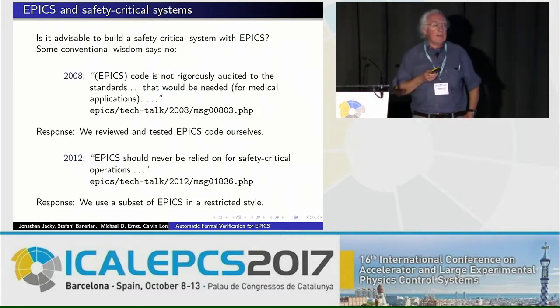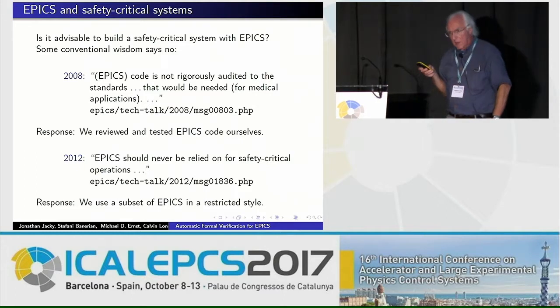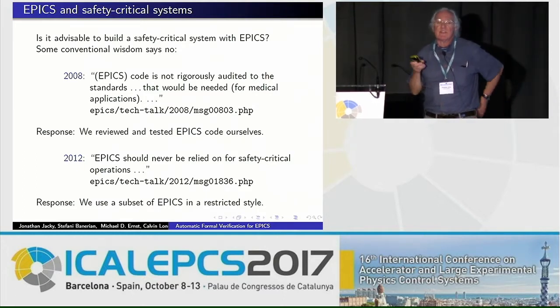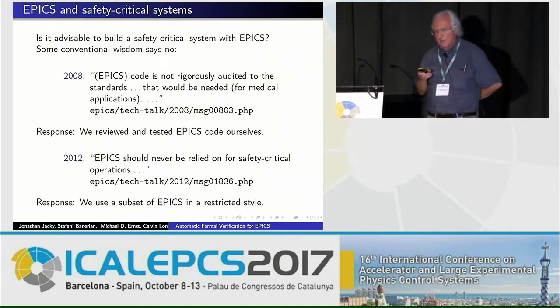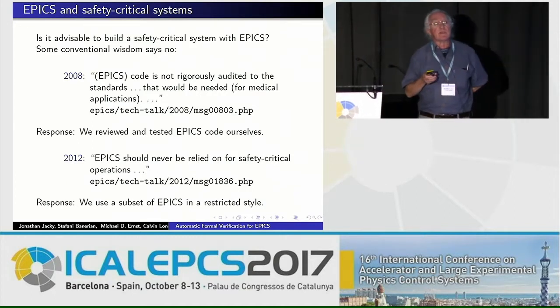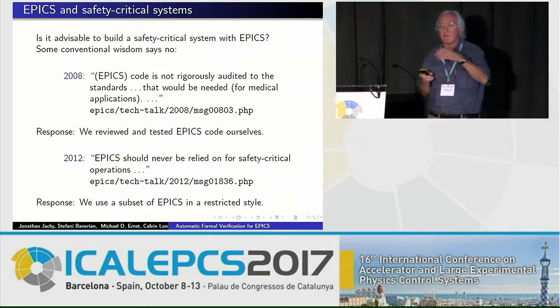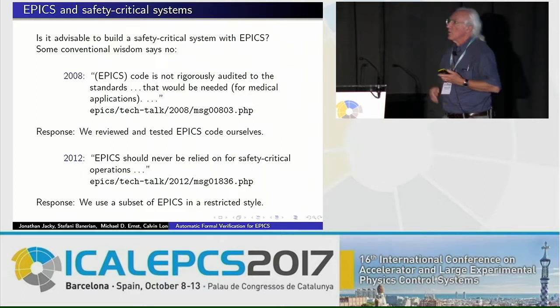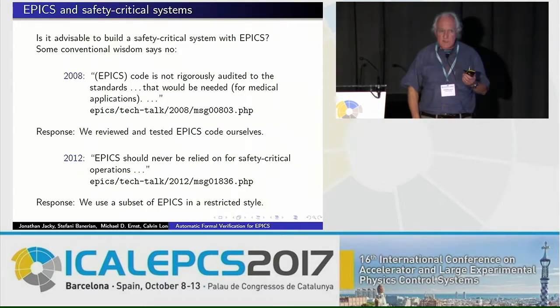So we had a lot of experience. By the time we began the control system project, we had several years of experience using EPICS with the cyclotron side of the installation, and we really liked this EPICS architecture, and we also wanted to have a single tool chain for all our projects. So we wanted to use EPICS for the therapy control system also.